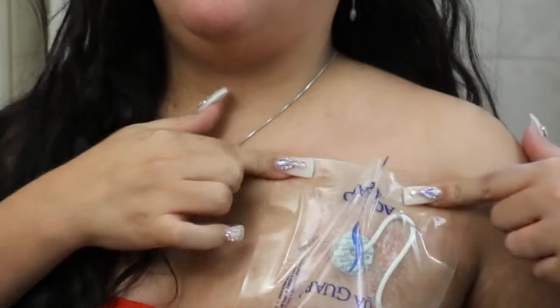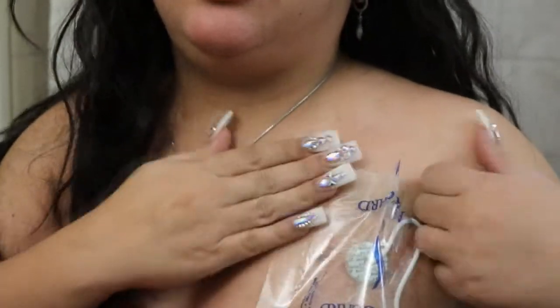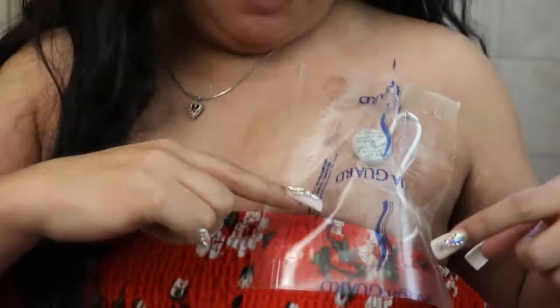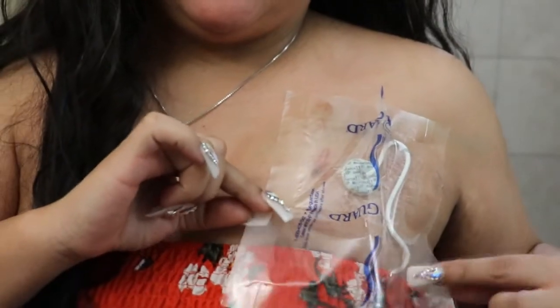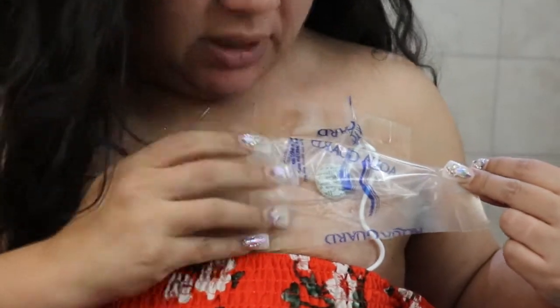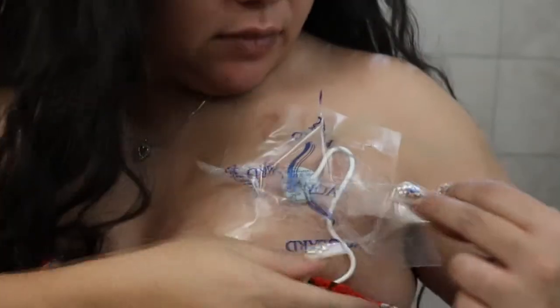And push this hard on the skin. Kind of like when your skin's dirty and you're pushing it on the skin, it's even better. So then here's the bottom of mine right here. I'm on my tippy toes, sorry. Make a little tent and put this on the very bottom. See, so now you have extra little space here.